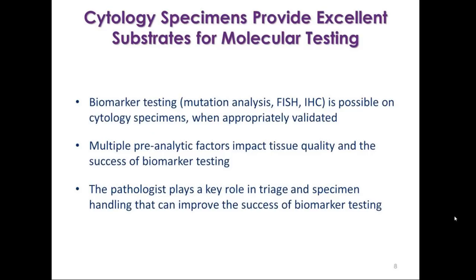So cytology, this is basically my summary slide. What I wanted to lay out up front is that cytology provides an excellent substrate for molecular testing. And when I say molecular testing, I'm talking about all kinds of assays, so the DNA and RNA-based testing that I mentioned, so mutation analysis, FISH, as well as immuno-based tests.